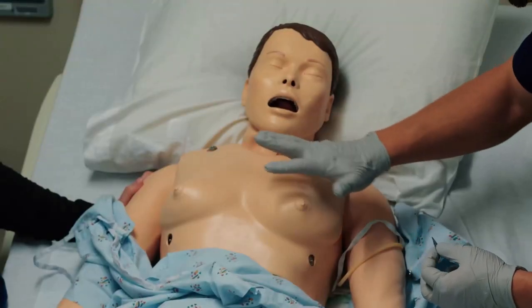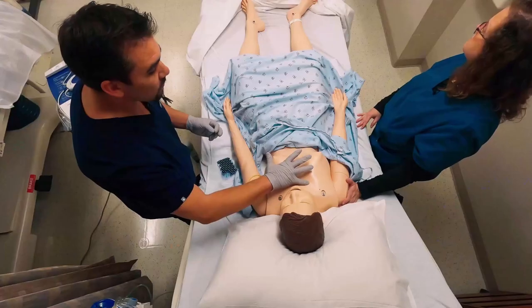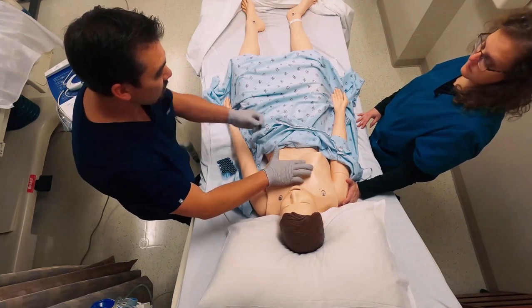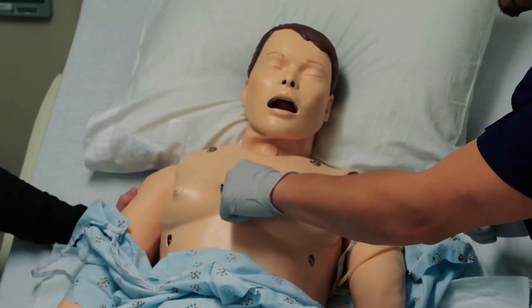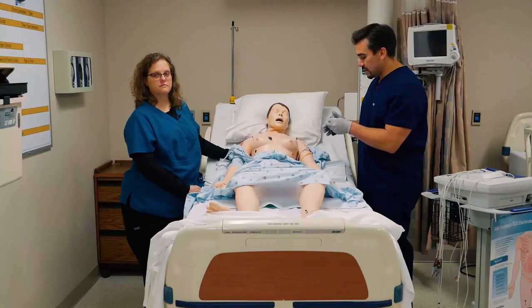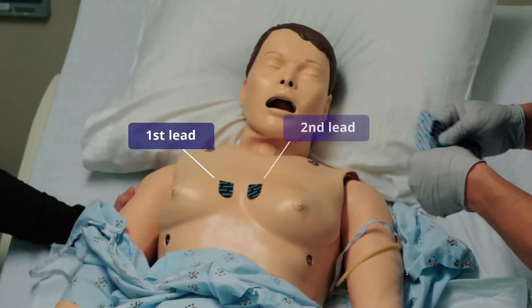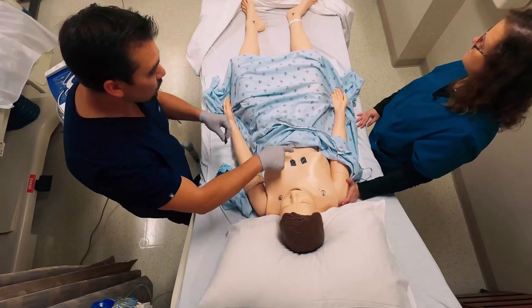For the first lead, measure from the collarbone and go four intercostal spaces down — you can feel in between the ribs: one, two, three, and four. The goal is to hit right in between the intercostal space, on the sides of the sternum. Never over the sternum, because it will block the electrical signal the leads are picking up. Lead two goes in the exact same position on the opposite side of the sternum.